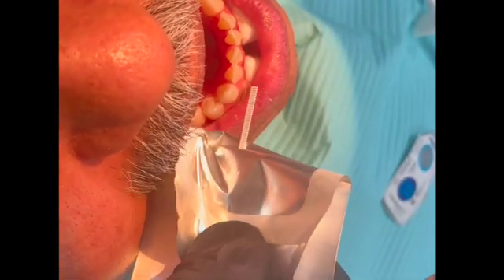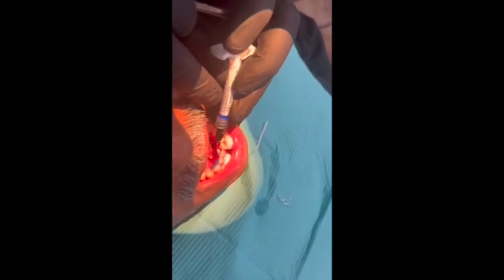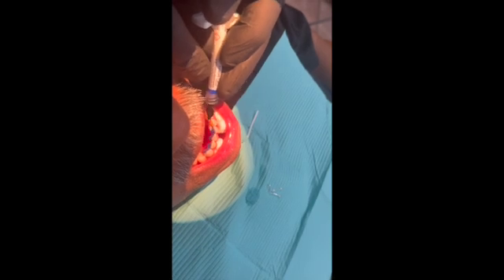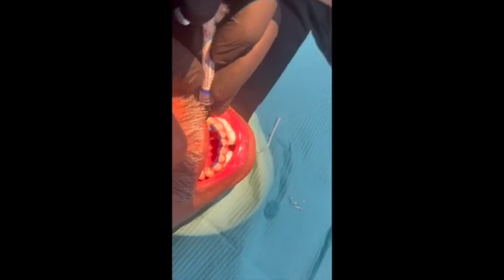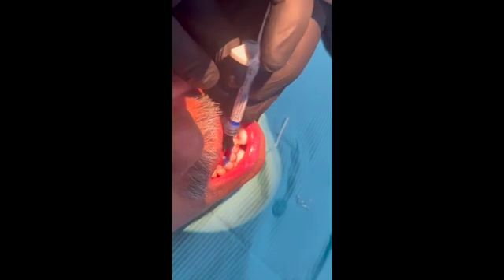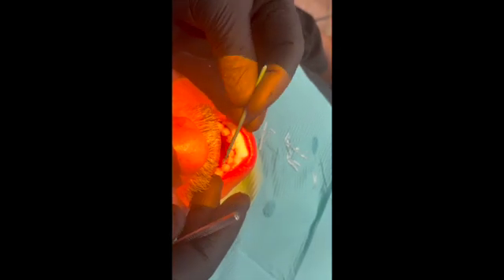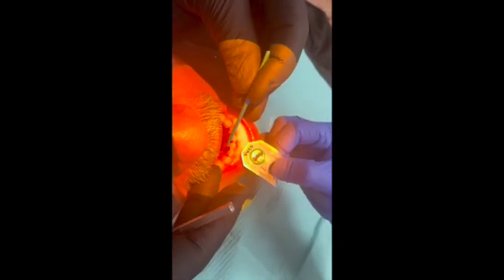The splint will go from cusp to cusp of the cuspid. The first thing you do is scrub with pumice, then etch the lingual parts of each tooth, rinse it off, and bond it — just like you're doing a regular composite filling.